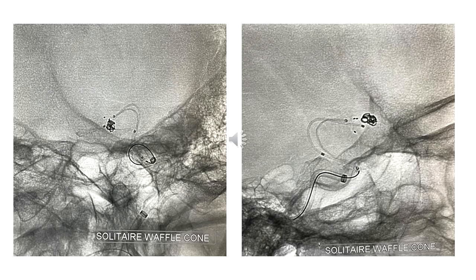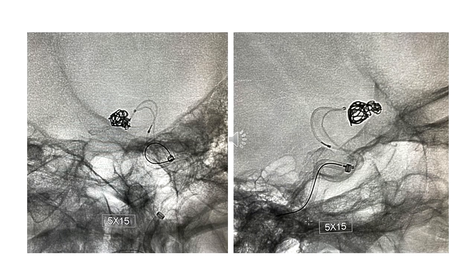So we can see here a Solitaire has been deployed. We can see these markers, distal marker. The Solitaire has been opened inside the aneurysm. We can see the delivery catheter. So there are two catheters here, one for coiling and one for the delivery of the stent. Coiling continues. This was a 5/15 coil, so we can see the previous coil in the lobule, and this is in the main body of the aneurysm.